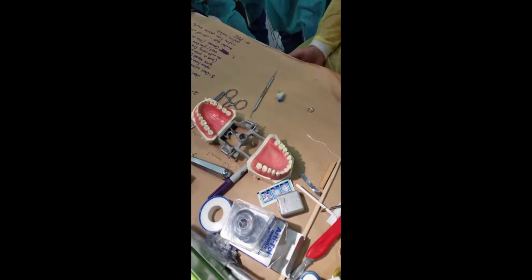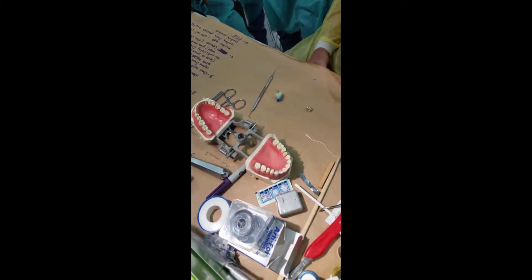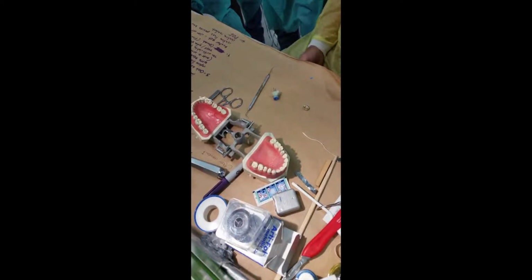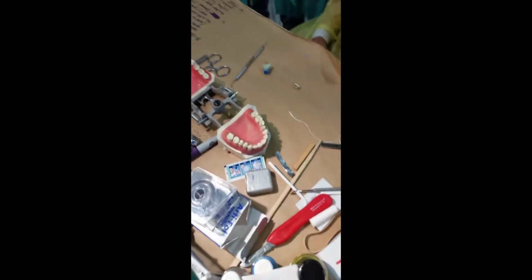So we'll remove the temporary. I don't say anything about local anesthetic here because that's optional. If the patient feels like they'll be more comfortable with local anesthetic, then you can go ahead and give it. Most people are willing to try without it. And I'd say four-fifths of the time or so, you don't need the local anesthetic.